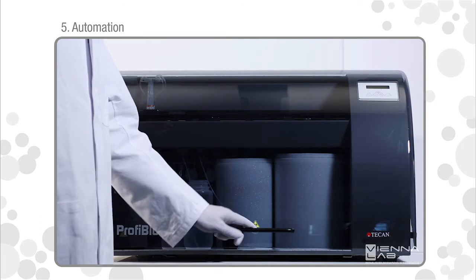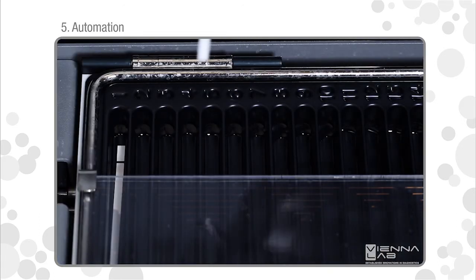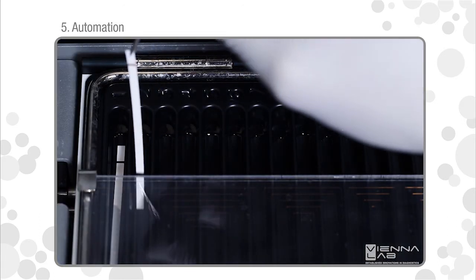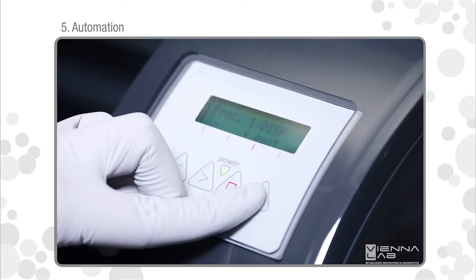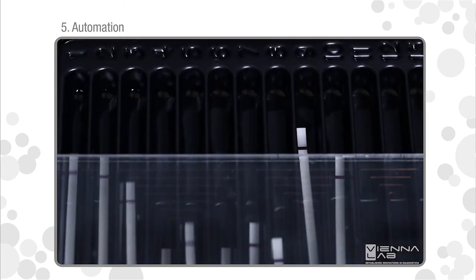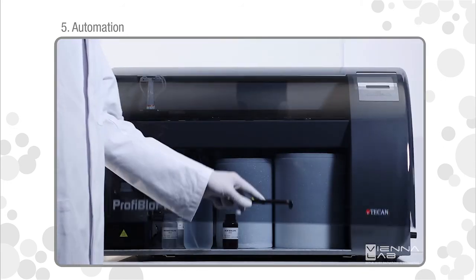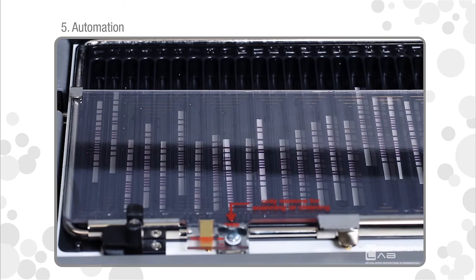The instrument pauses automatically. Insert test strips with marked side up into the respective lanes and confirm the next program step. Analyze your samples manually or with the strip assay evaluator software.